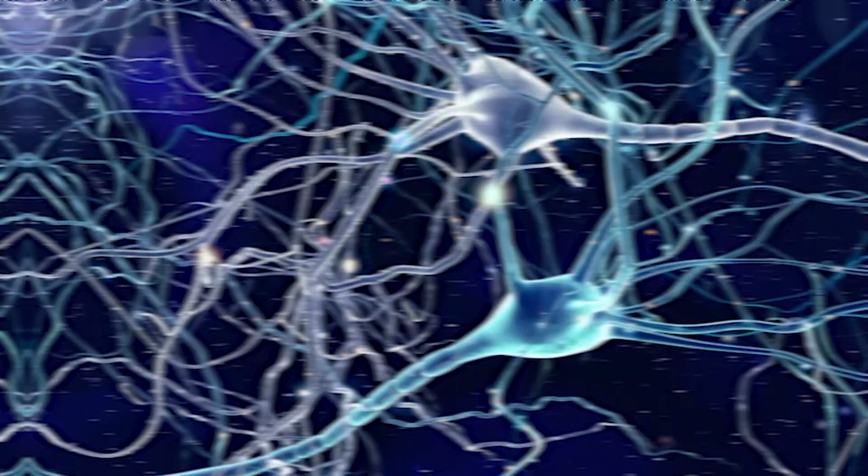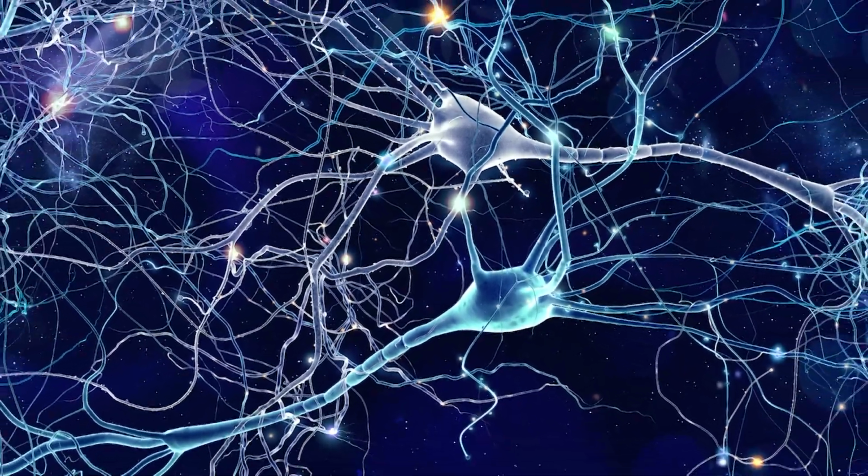If we talk of the basic principle of the EEG, it operates on the fundamental principle that brain activities generate electrical signals due to the communication between neurons. These electrical signals, often referred to as brain waves, are crucial indicators of brain function, cognitive states and neurological disorders.